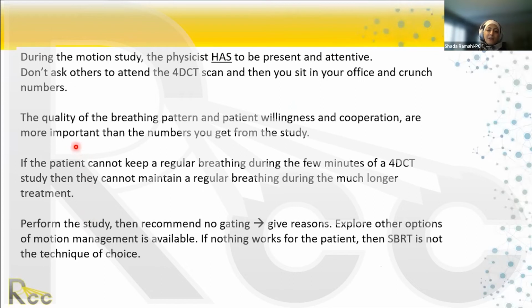And again, I have here that the quality of the breathing pattern depends on patient willingness and cooperation, but actually it also depends on the patient's health status, which I should also mention in the slide, it goes without saying. If they cannot keep a normal breathing pattern for whatever reason, then you, the physicist, and the radiation oncologist look at what you have in the department, what other things you can offer. We can do chest compression, you can do DIBH, etc., and try to do that for the patient. I have seen motion studies that would go into 2 hours on the CT sim.